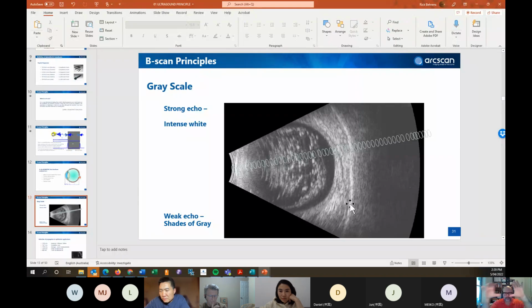So you have those 3 movements happening at the same time. We can replicate the linear scan, yes, and we can do the arc scan, yes. What we cannot do is what a regular ultrasound does, just moving that way, because there is no benefit to it. Okay, I see that. Okay, thank you.